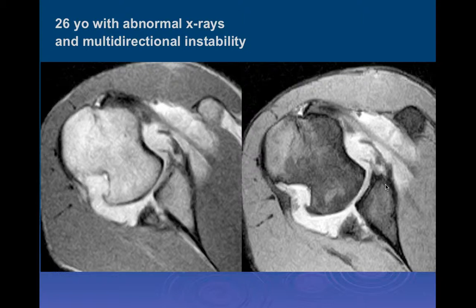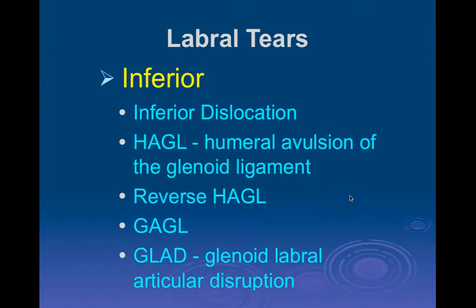Again, I think there's a dysmorphic glenoid here. It looks very shallow, maybe a little bit retroverted, and there's a huge tear of the posterior labrum. This is an arthrogram, so I think that's why we have all that increased fluid. Then there's that V-shaped abnormality in the posterior humeral head. And I was looking at the ligament, but I'm having a little bit of difficulty going between the ligament and the anterior labrum there. So maybe that's an anterior labral tear.